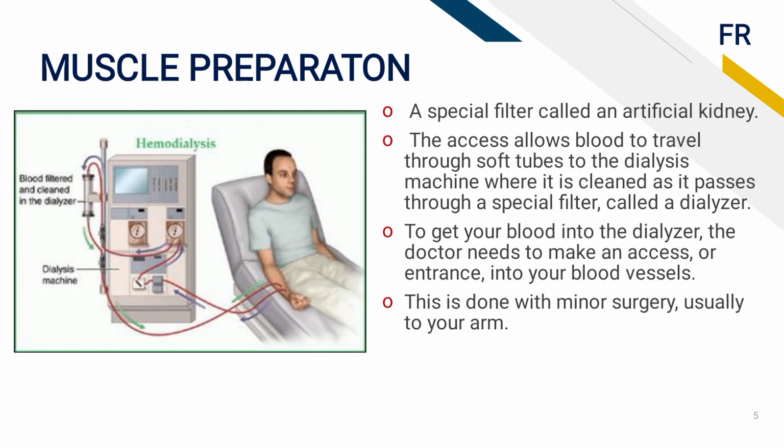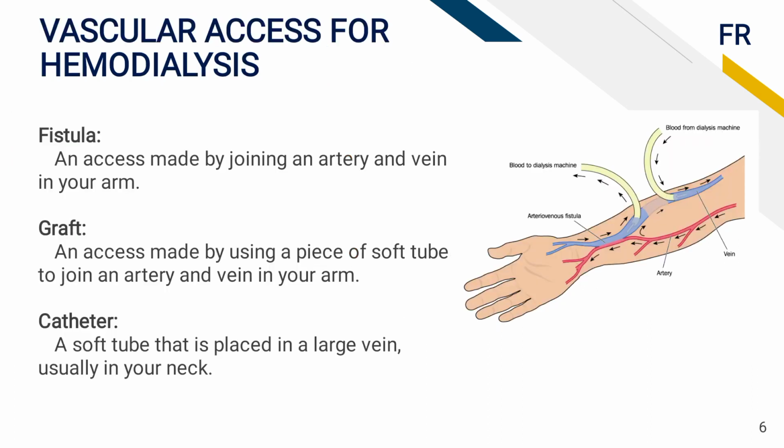And when your blood is taken from your body, just think of when you're drinking juice from a tin can with a straw, and you pull more than it requires, the straw twists itself. Similarly, when a needle is placed in your artery and blood is sucked from the veins, and the machine sucks more blood, your vascular system contracts and your body collapses, right? So in order to prevent that, doctors do a surgery to maintain the pressure.